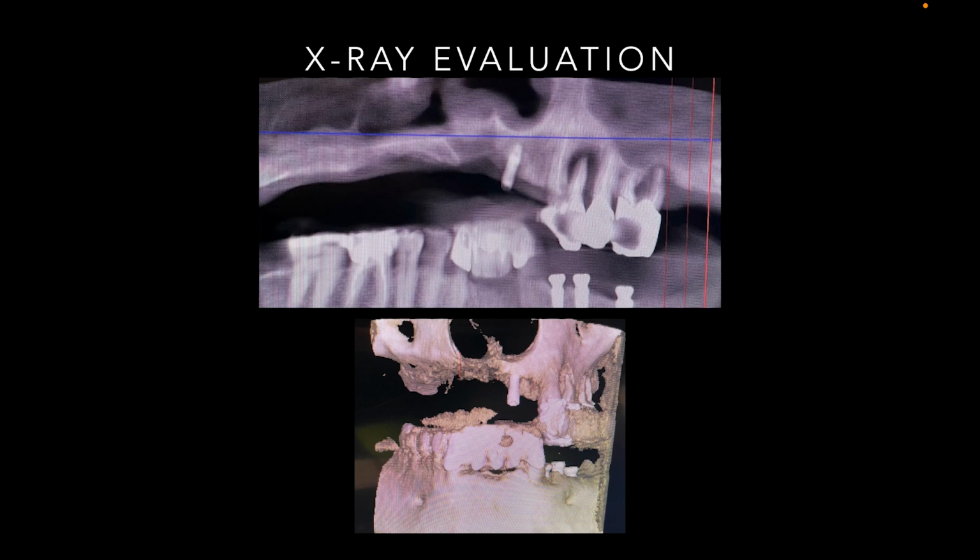So these are the kind of things you're going to look at when you determine to do zygomas. So not only from a panorex version of it, you're going to see what those sinuses look like. You're going to look at the Zaga classification to see how your osteotomy is going to go, if it's an intrasinus or an extrasinus approach.